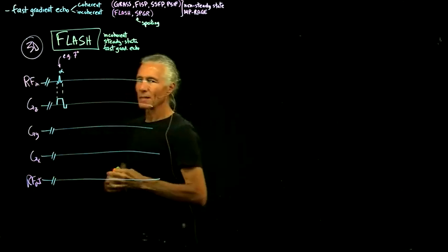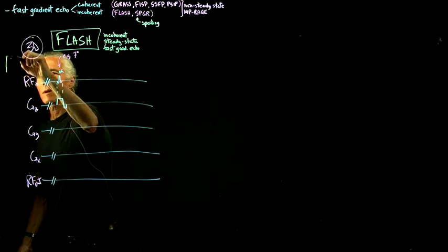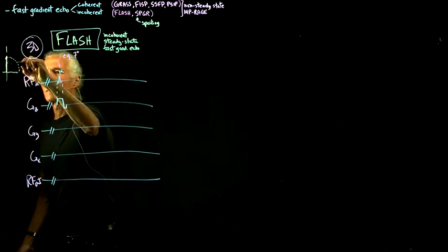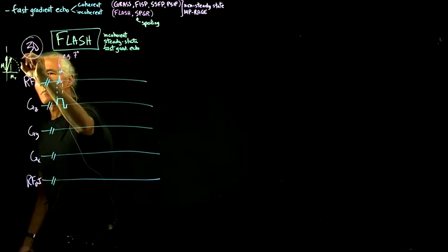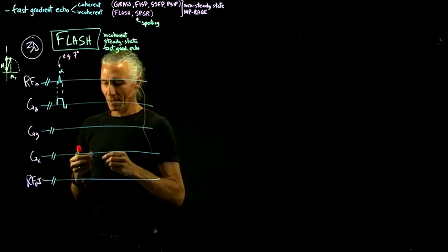And the reason for that is basically we're not wanting to kill our longitudinal magnetization. So if this is our flip angle, if we go all the way to a 90, we'll have no longitudinal left. So that's M L, and this is M T. If we just do that, we get a sizable amount of transverse here, but we've hardly cut our longitudinal at all, and so that's why we do a low angle.